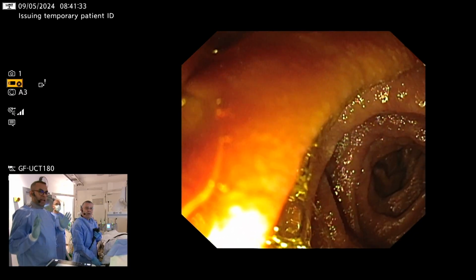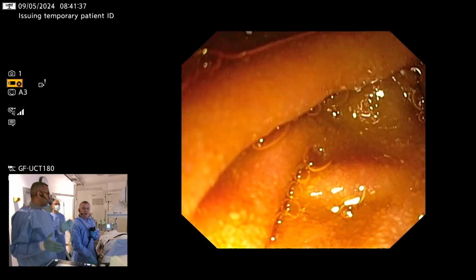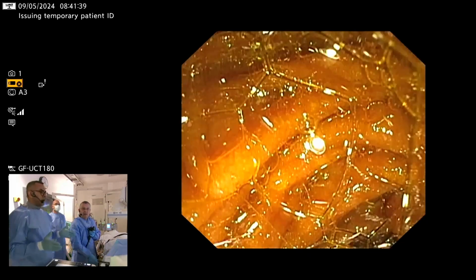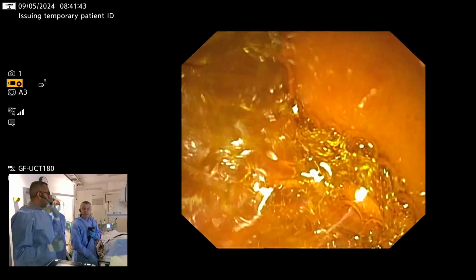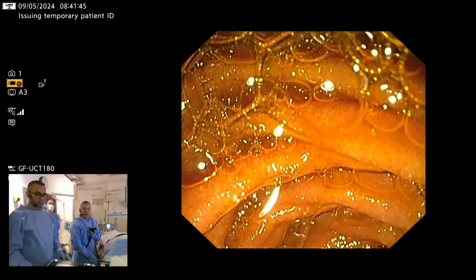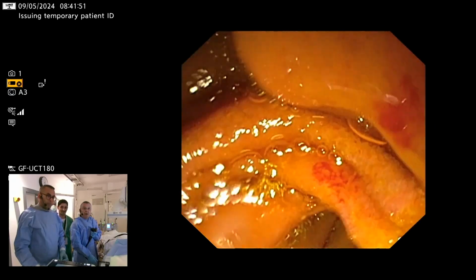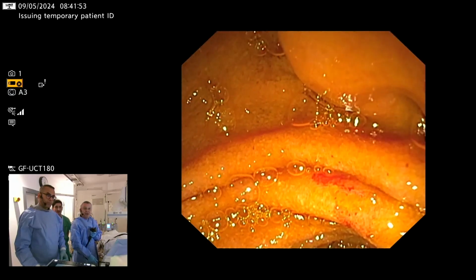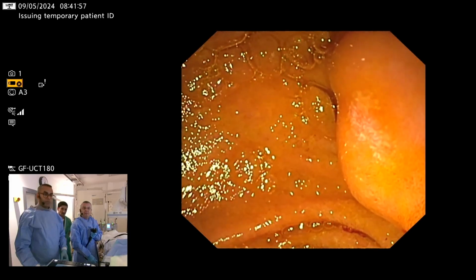So, Dr. Palazzo, just a last comment. If Prof. Palazzo would agree with me, ampullary evaluation should contain both EUS evaluation, endosonographic, and endoscopic evaluation. Yes, of course. I don't see a stricture, Imad. I'm an endosonographer, so papilla and ampulla need to be seen endoscopically as well as on the EUS.